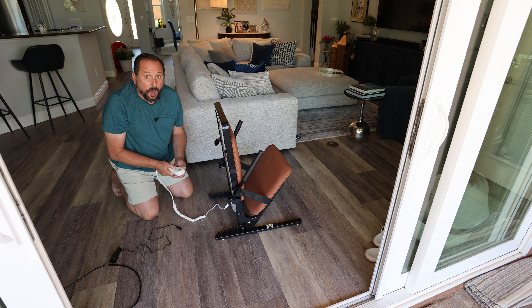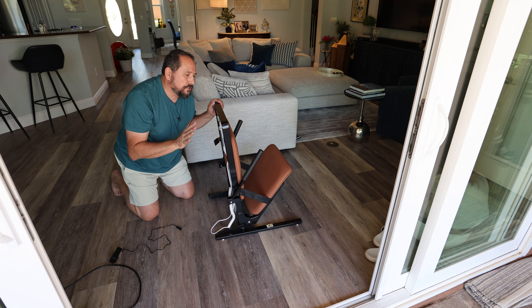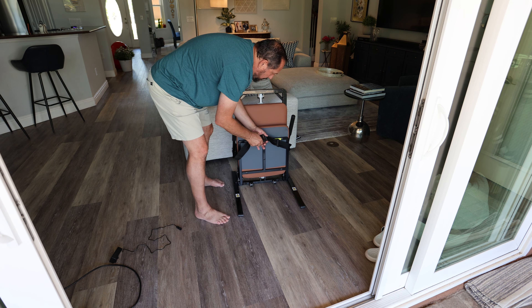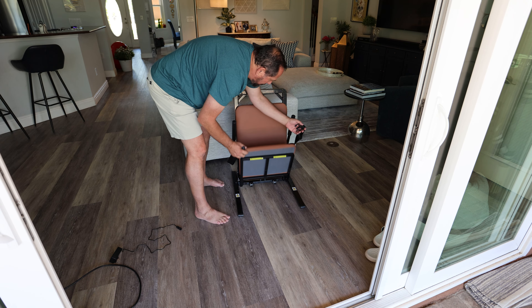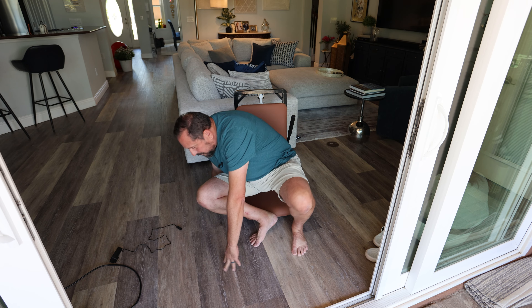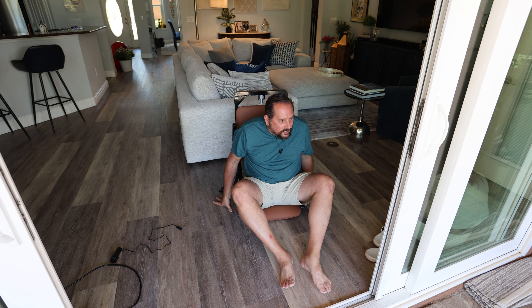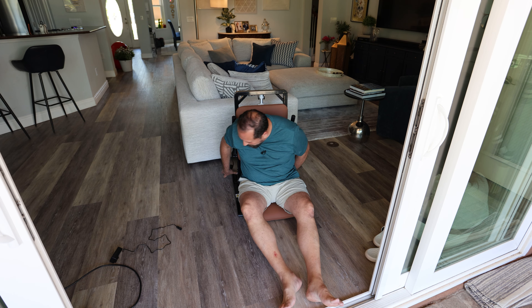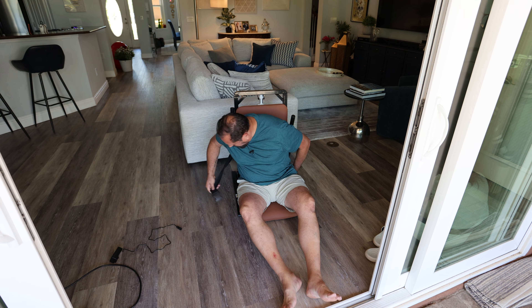Just so you know, it takes about two and a half hours to charge fully. Seatbelt — common sense — you want to use the seatbelt. This will lift up to 440 pounds. All right, let's go — seatbelt on, safety first, put the arms down.